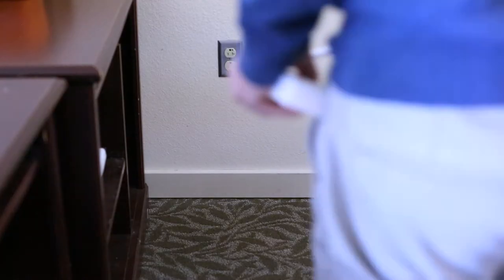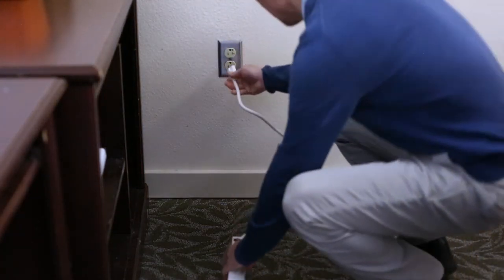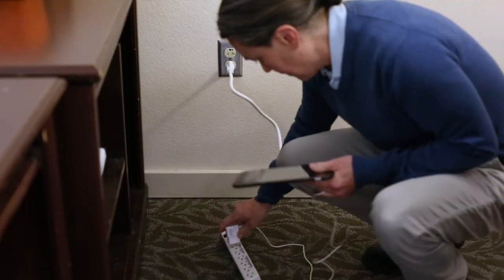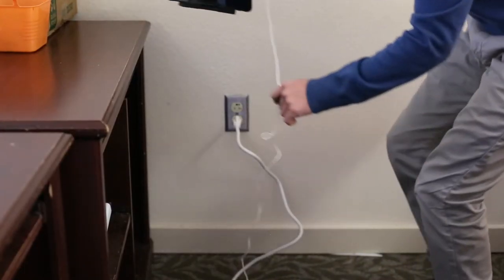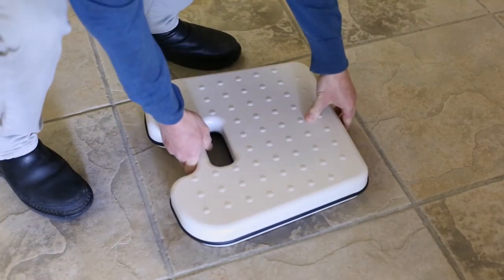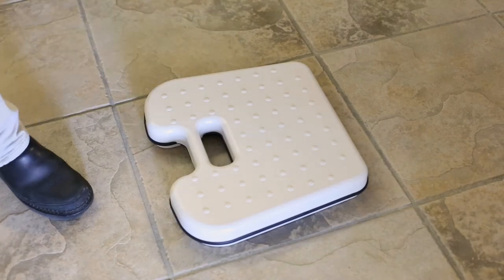You will want to find a place in your home where the equipment can remain plugged in. All equipment should be kept in the same area. If you have a scale, you will want to be sure the spot you choose is one where the scale is on a hard surface.